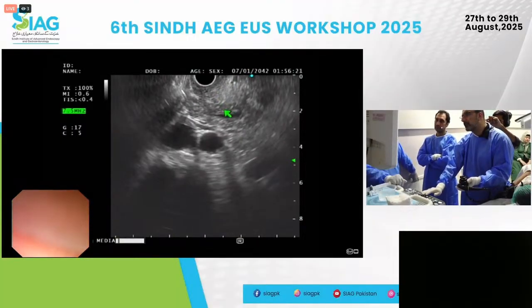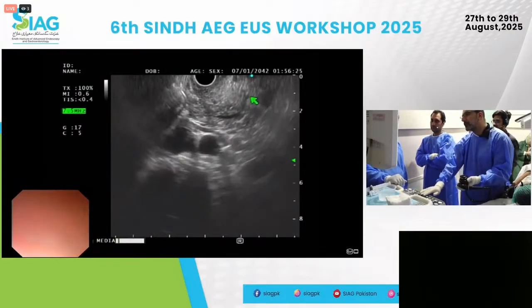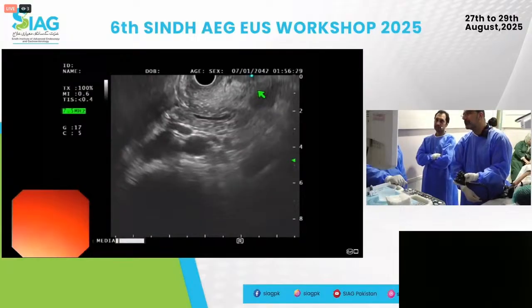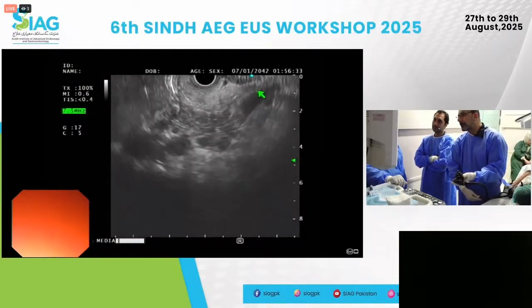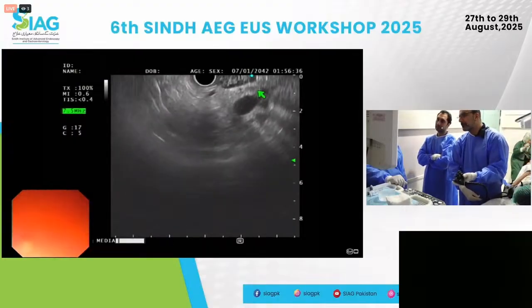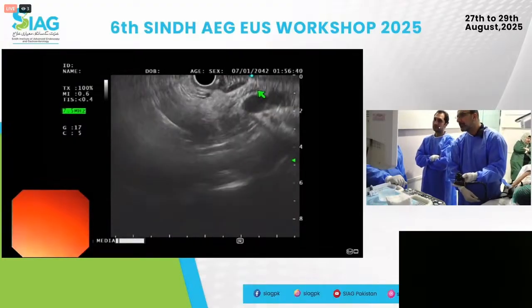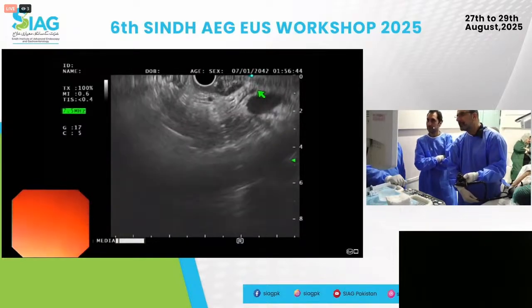Here, in fact, what you see is the ventral crossing over from ventral to dorsal, which is telling you that this is not divisum. And then you can follow this duct. Here, it gets compressed by the probe, so sometimes you lose visualization. But you'll see there's the duct now, right there, where the arrow is, coming across nicely over the portal vein.